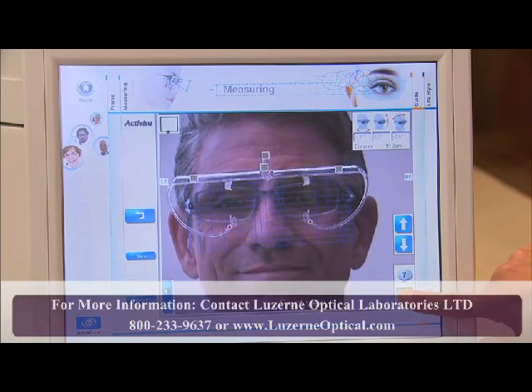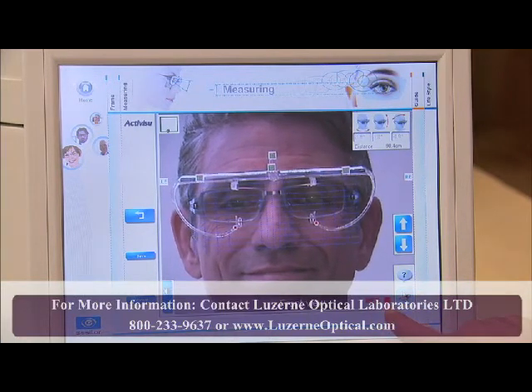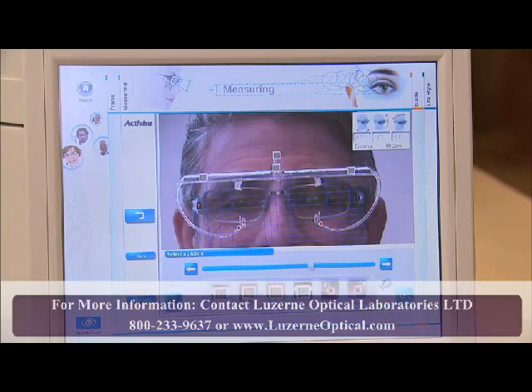The VisiOffice system will take a brief video of the patient, stopping automatically when complete. The software will then select the best individual shot on the screen. After reviewing, press OK.